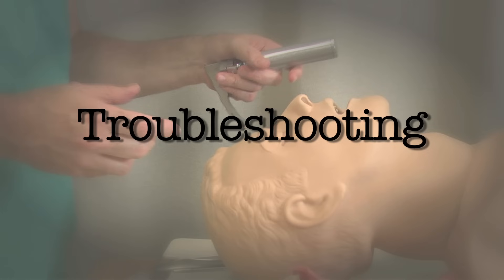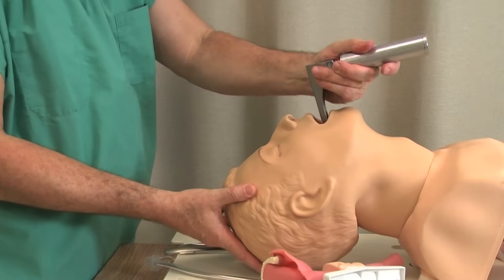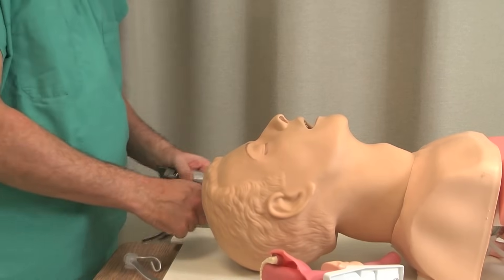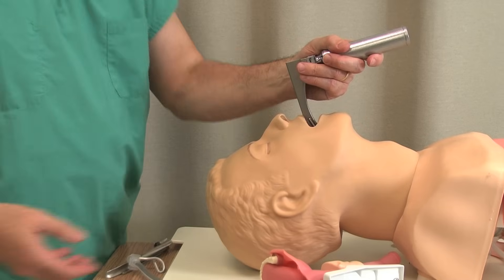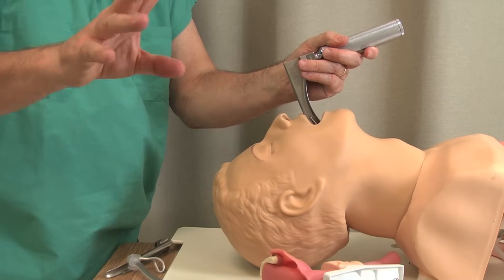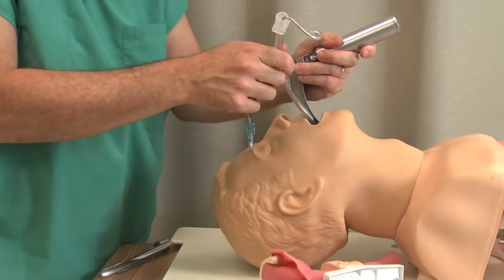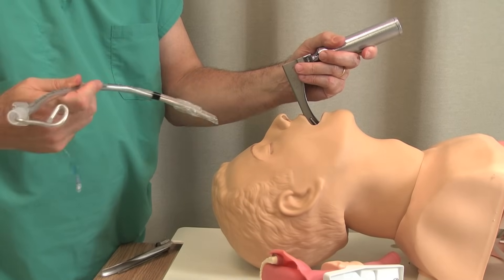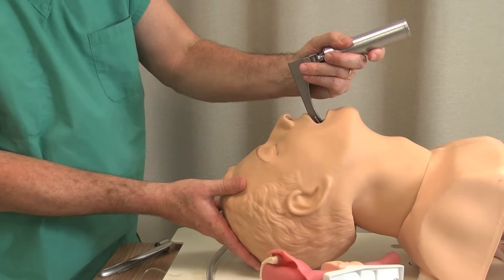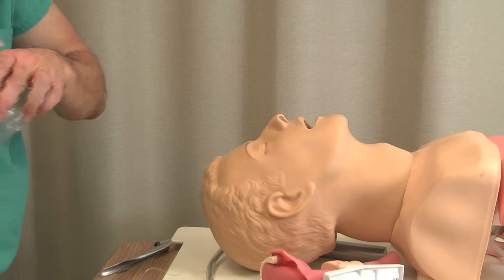I'm going to show you on the mannequin a few things you can do if things don't go right. In a perfect world you get perfect position, put the laryngoscope in, get a great view, tube goes in, life is good. But you might go in and have no view at all. The wrong thing to do is to keep trying — that's going to cause bleeding, edema, a nightmare. What you want to do if things don't go right is buy yourself a little time. There's an old saying: you don't have to intubate, you only have to ventilate.